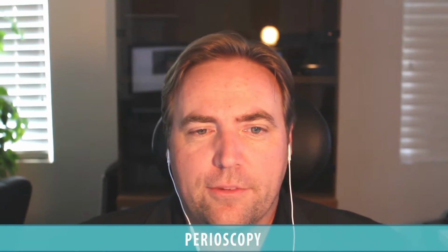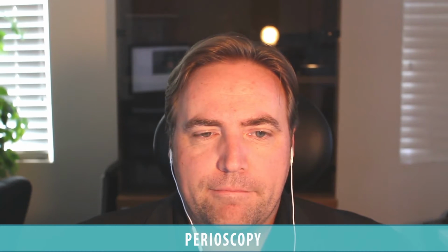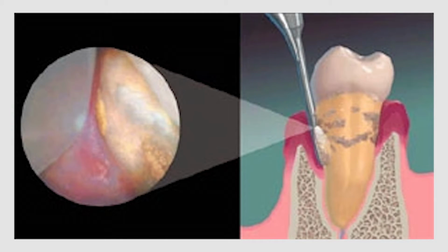Now, on today's show, we're going to talk about, as I mentioned, perioscopy. As I understand it, this is a microscope that gets inside the gum pockets to detect plaque and buildup that causes gum disease. Let's talk a little bit about that procedure. Tell me, how long has it been around, and what is it?